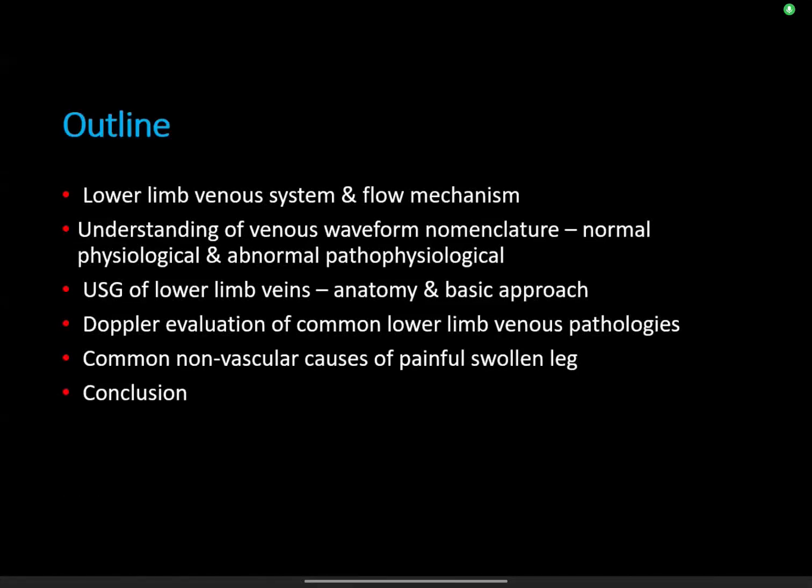The outline of my presentation is: we will see the lower limb venous system and flow mechanism, understanding of venous waveform nomenclatures, normal physiological and abnormal pathophysiological changes, Doppler evaluation of lower limb veins, anatomy and basic approach, Doppler evaluation of common lower limb pathologies as well, and some common examples of painful swelling, non-vascular causes.